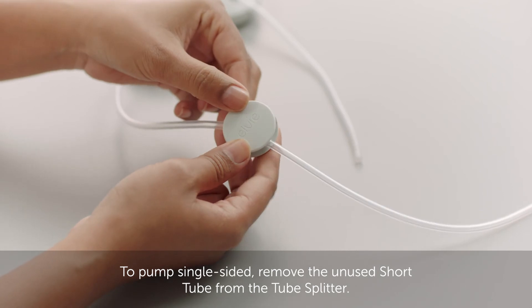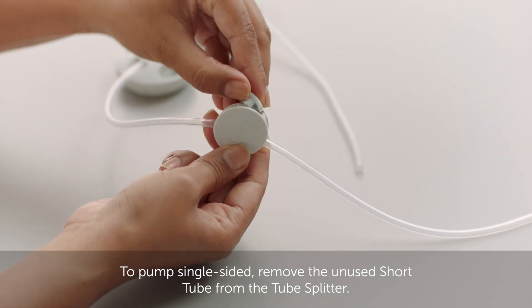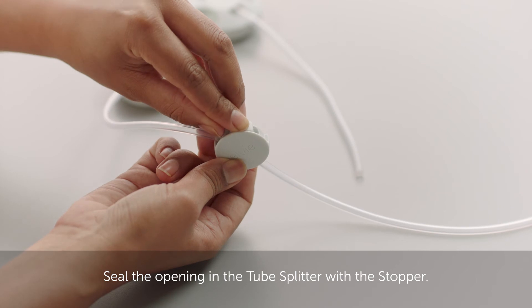To pump single sided, remove the unused short tube from the tube splitter. Seal the opening in the tube splitter with a stopper.